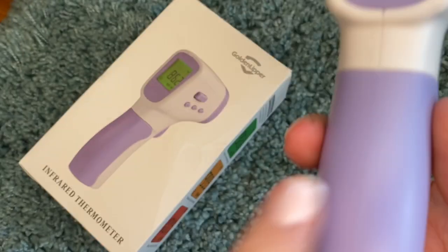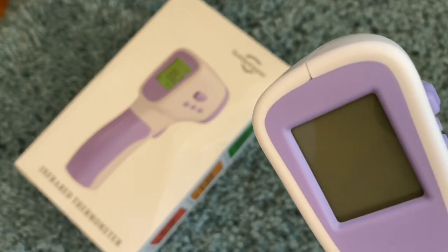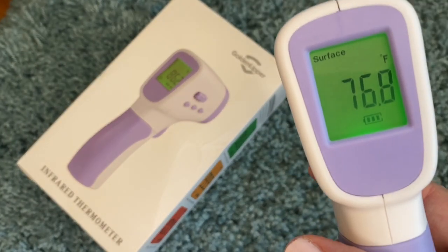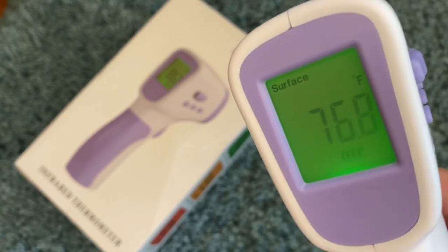Getting that setting changed has been the biggest challenge for most people. So I'm going to show you how. Basically this is the battery compartment — you just pop it open and it takes two triple-A batteries. You push that button to turn it on. I've already got mine switched to fahrenheit but I'm going to show you how to switch yours as well.